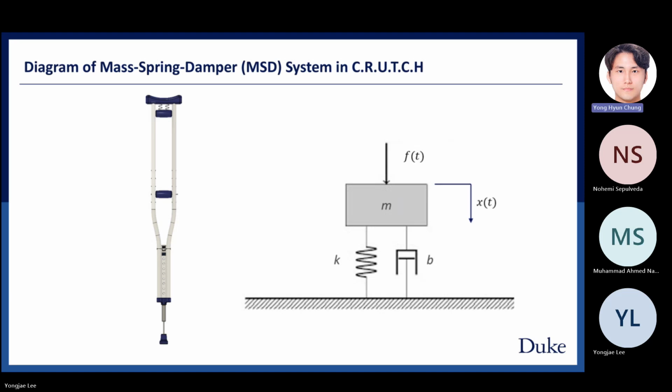By incorporating the mass spring damper system into our crutch design, we provide users with shock absorption tailored to their specific loads. This adaptation ensures both comfort and efficiency in motion.